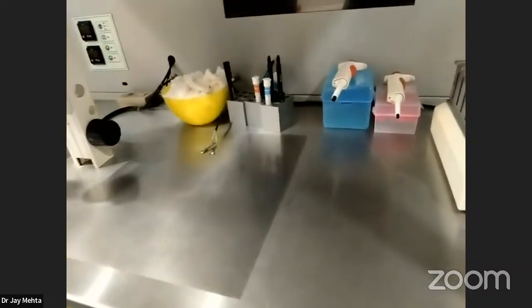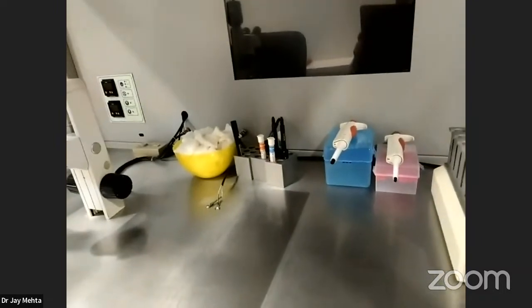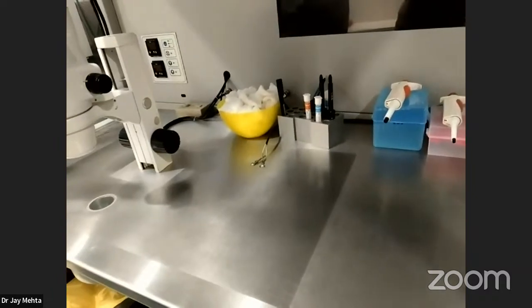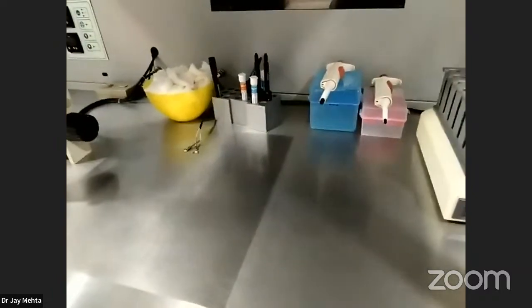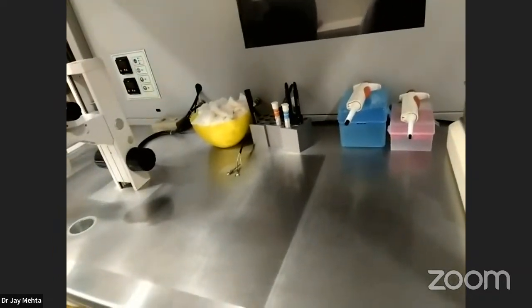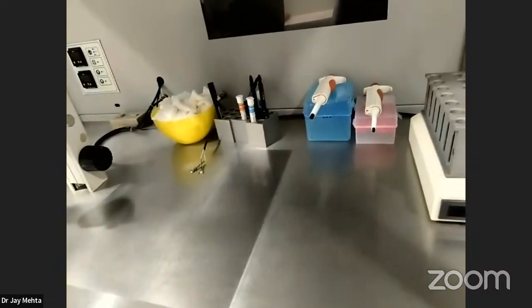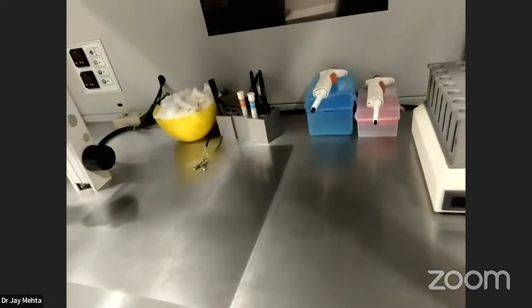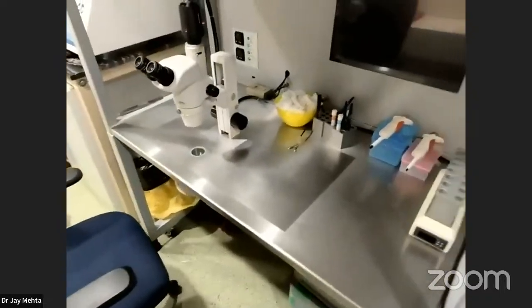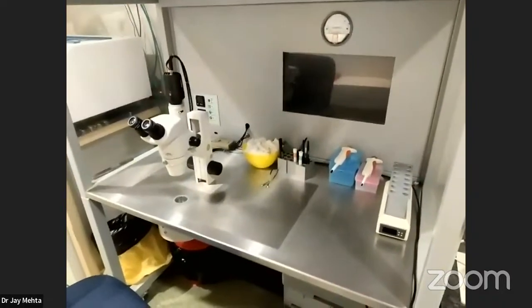A lot of times people will do, just like how they do for their operation theater, a swab culture for their IVF laboratory. The microbiologist will come and pick up air samples, samples from the plates, samples from the ICSI machine and all these things. And I try to do it once every 15 days, because of the workload which I am handling. But if you are doing batch IVF, then the best way to handle this is not to do it once every 15 days. In batch IVF, you can do it just 10 days prior to your batch. That is just something which you can keep in your mind.